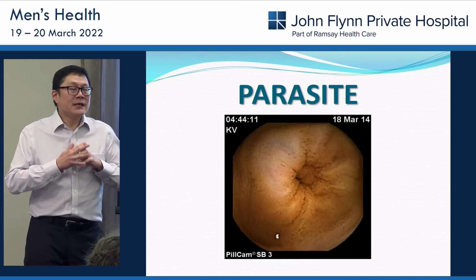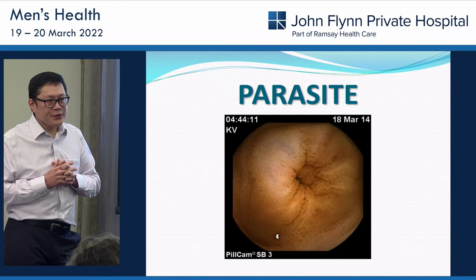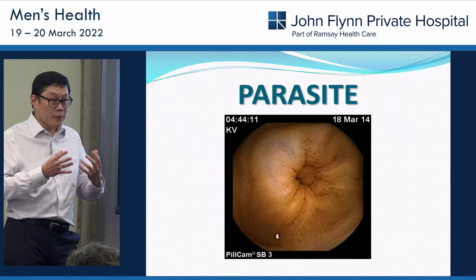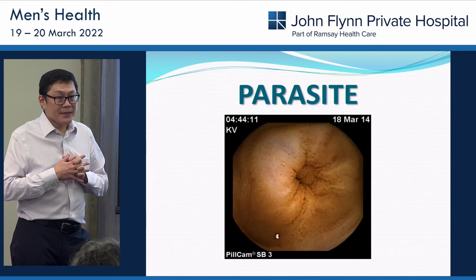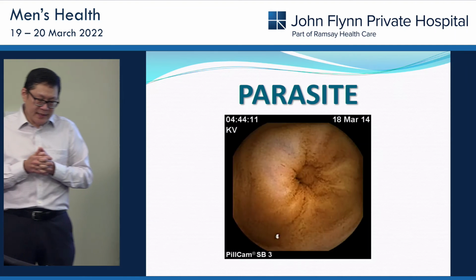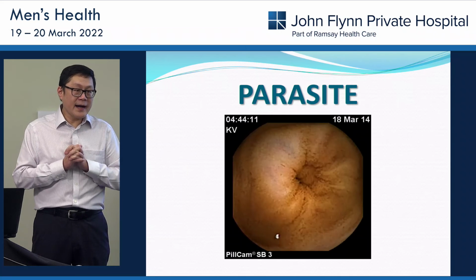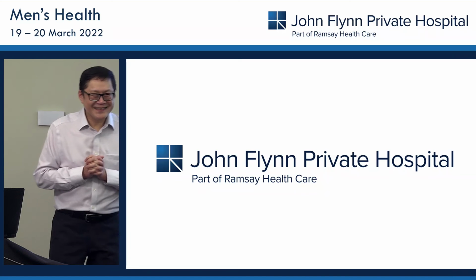Okay. So you don't always need to use the bowel prep, for capsule, I presume? Yeah. So for capsule, we frequently do give one dose of bowel preparation. If they can't take Pico prep or Pico select, they can always take one of the others, which are more volume based. But that gives a little bit of a washout and better views, usually towards the end of the small bowel in the ileum. Yeah, that little bit of washout seems to make an extra difference.